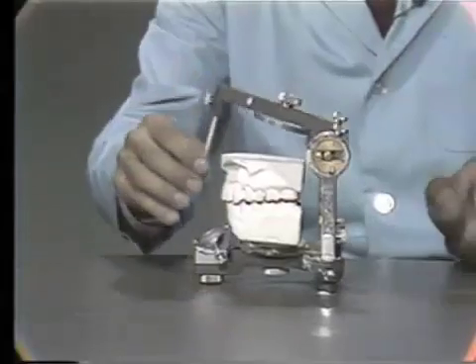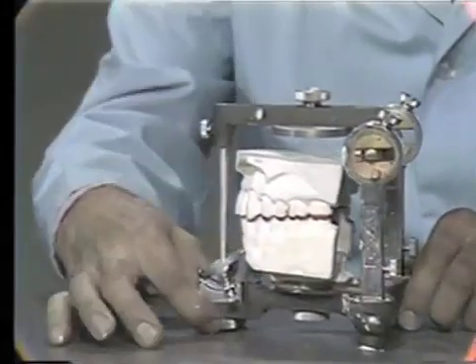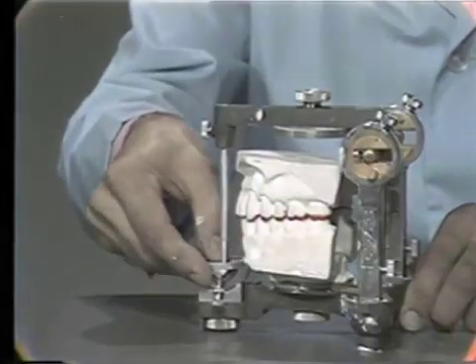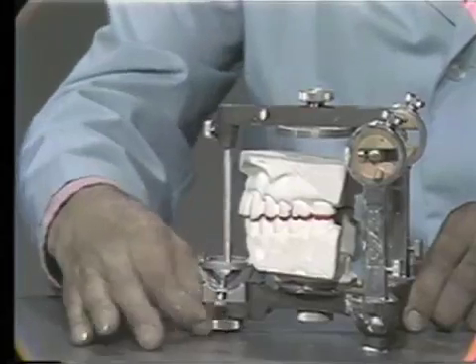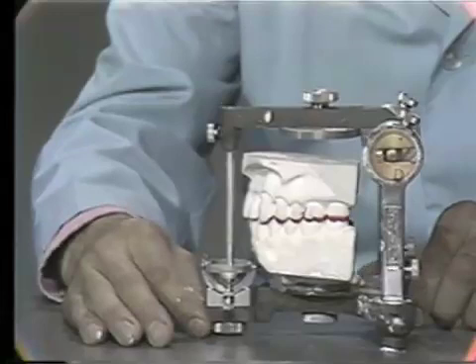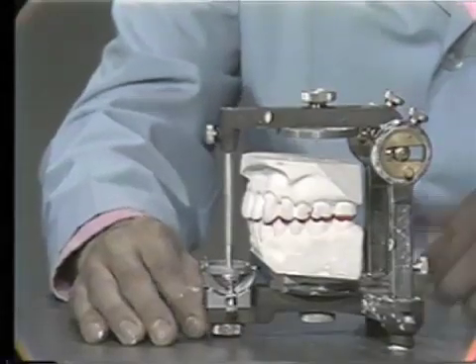When we close the articulator, you always should close the articulator on the upper to check to make sure that you have the correct positioning. Set your incisal table back to zero. You notice here that the upper ends up coming with about a quarter of an inch of the incisal pin.